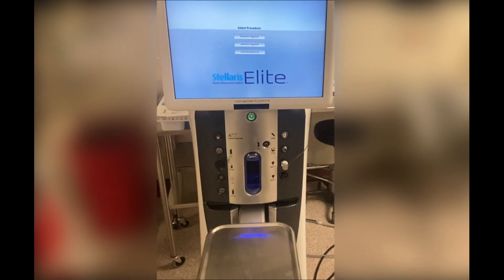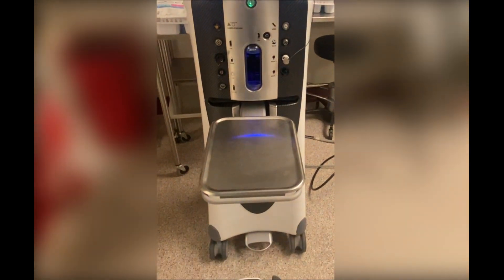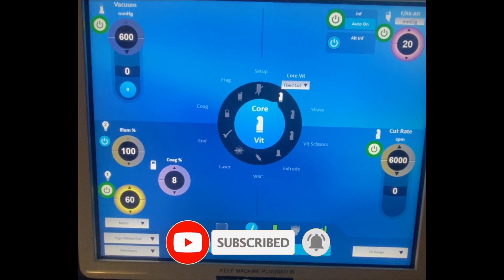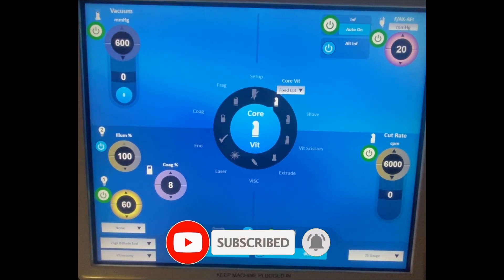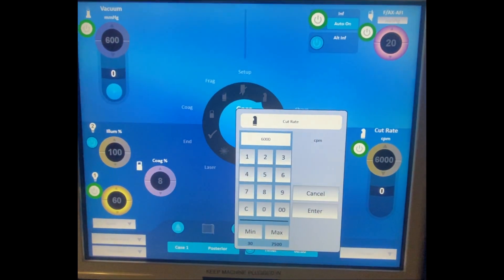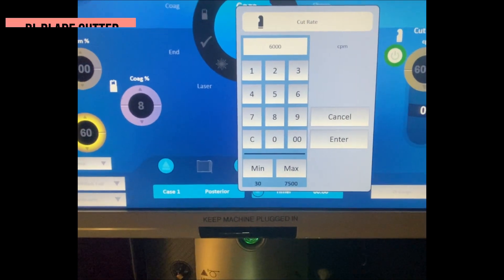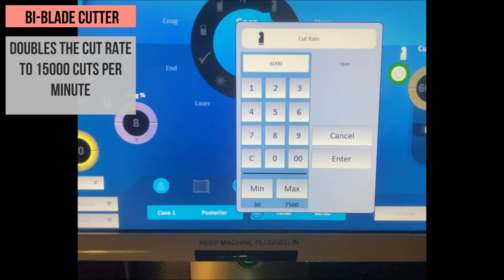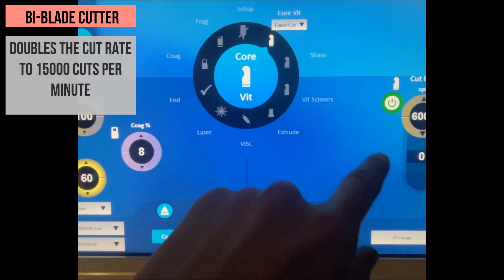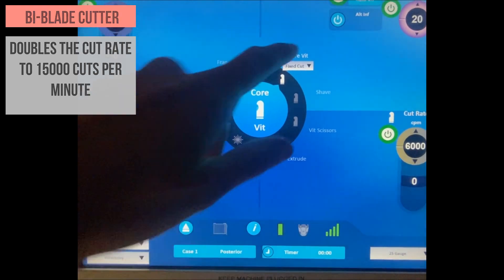The Stellaris Elite System was first introduced in 2017. When using a single port vitrector that cuts only in the forward direction, the cutting rate of this system can reach up to 7500 cuts per minute. However, by utilizing a bi-blade pneumatic cutter that can cut in both the forward and backward directions, the cut rate can be doubled to 15000 cuts per minute.